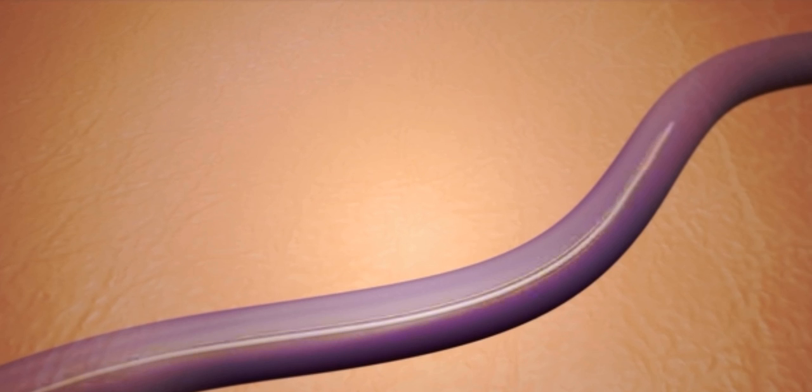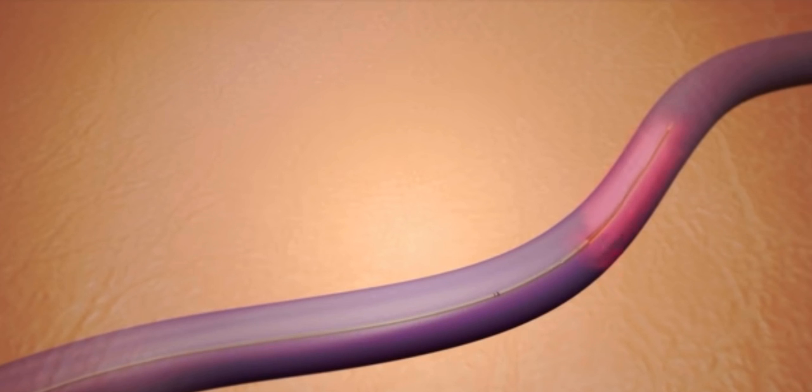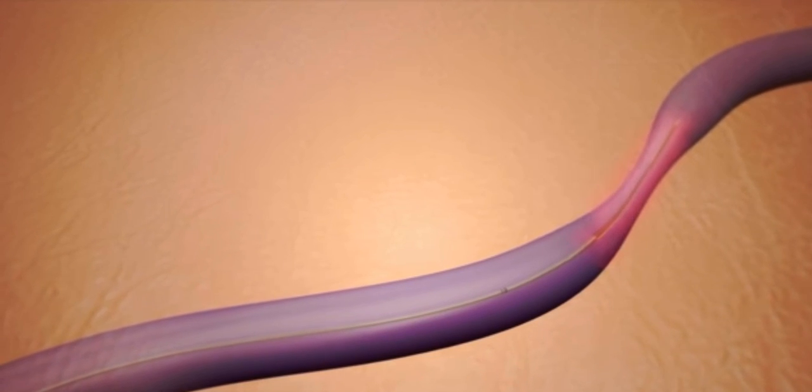The guide wire is removed and the doctor gently places a small radiofrequency fiber inside the sheath, into the vein, and radio wave heat is delivered to heat and collapse the targeted vein.